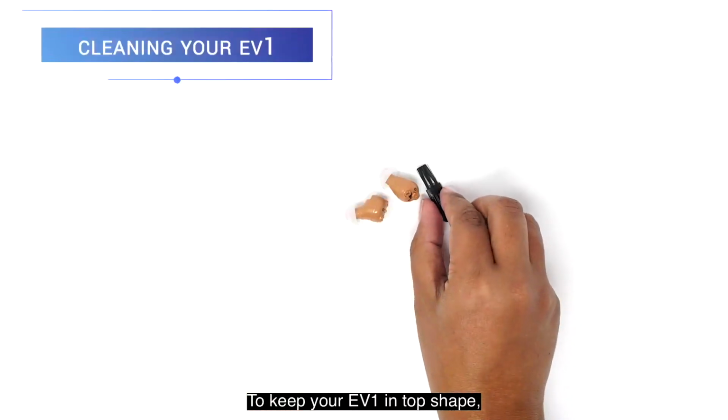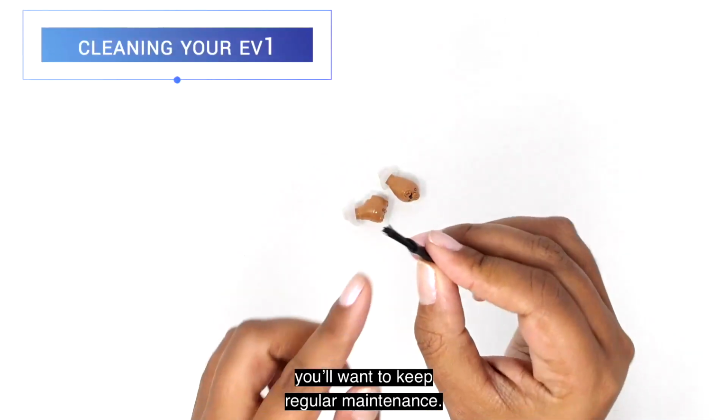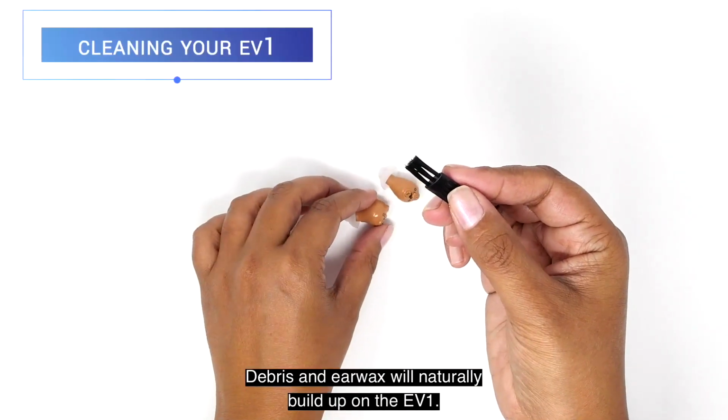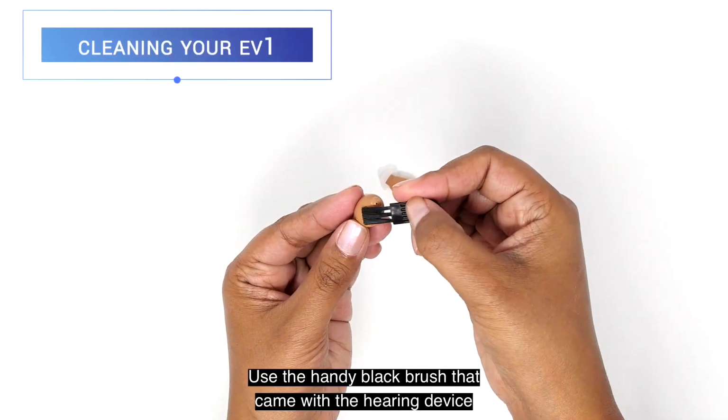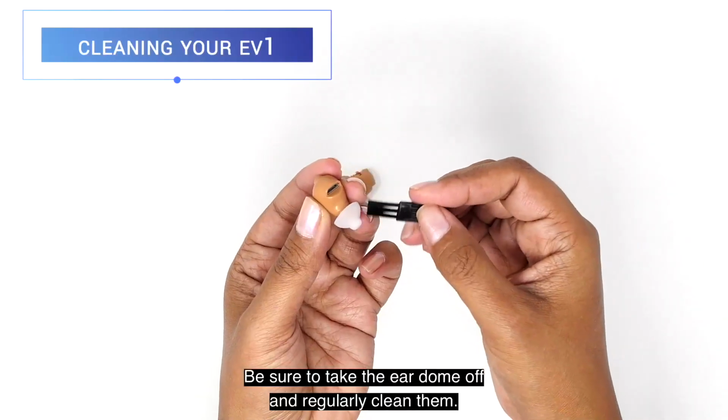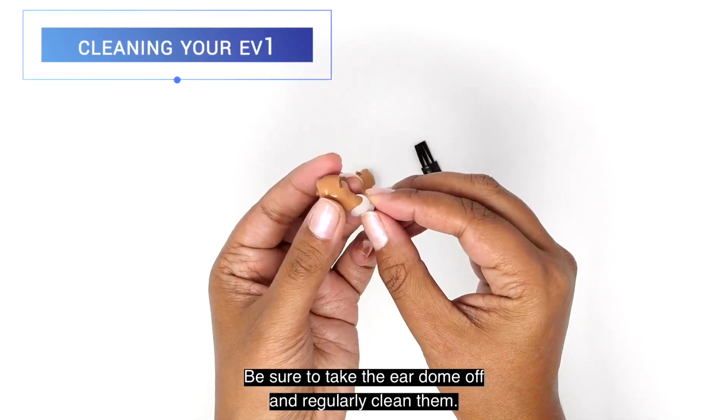To keep your EV1 in top shape, you'll want to keep regular maintenance. Debris and earwax will naturally build up on the EV1. Use the handy black brush that came with the hearing device to remove debris. Be sure to take the ear domes off and regularly clean them.